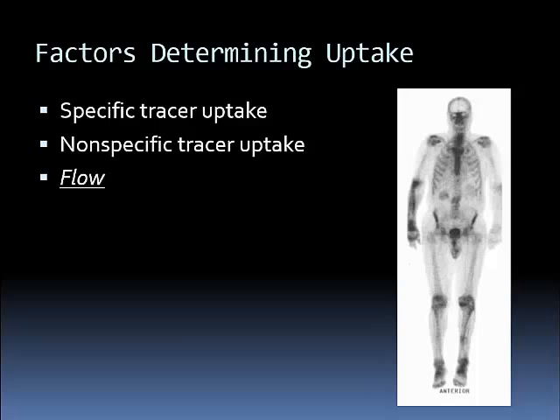You want to make sure they're not developing a pseudoaneurysm or hematoma or anything like that. We had used a very small butterfly catheter and stuck it in and pulled it out, and there was no complication. But it is imperative to investigate and examine these patients to make sure there's no vascular compromise, because puncturing the artery with, say, an 18 gauge needle can result in a vascular leak and pseudoaneurysm formation. So again, this is nonspecific activity related to intra-arterial injection.